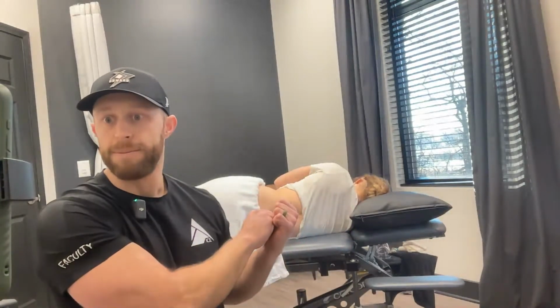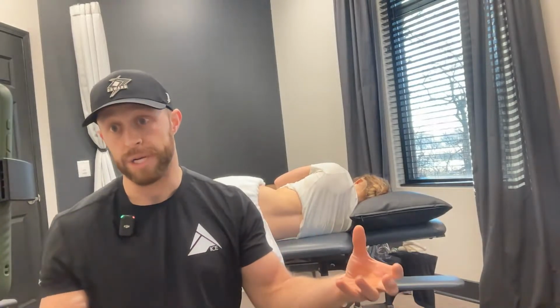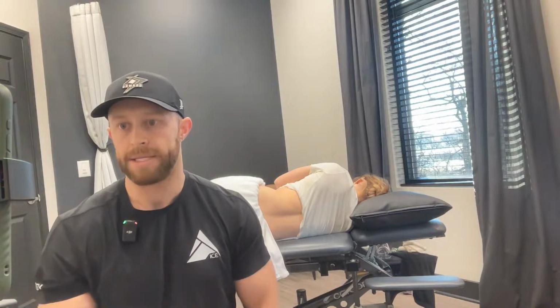This will often be the position they've told you in the subjective exam that they like the most. So we're going to go right to that position and then treat in that position. So I'm going to move to the other side of the table, show you sort of where I put the cups, some of the verbal cueing alongside of that, and then we'll wrap this thing up and summarize at the end.